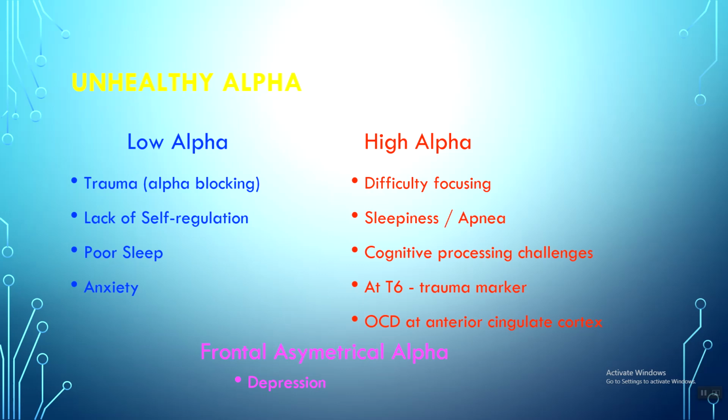When you have frontal asymmetrical alpha and you say depression, is there a particular side, left or right, or no, just the difference? It's a good question. It's a Yuri Kropotov answer. Can you clarify what is asymmetrical?